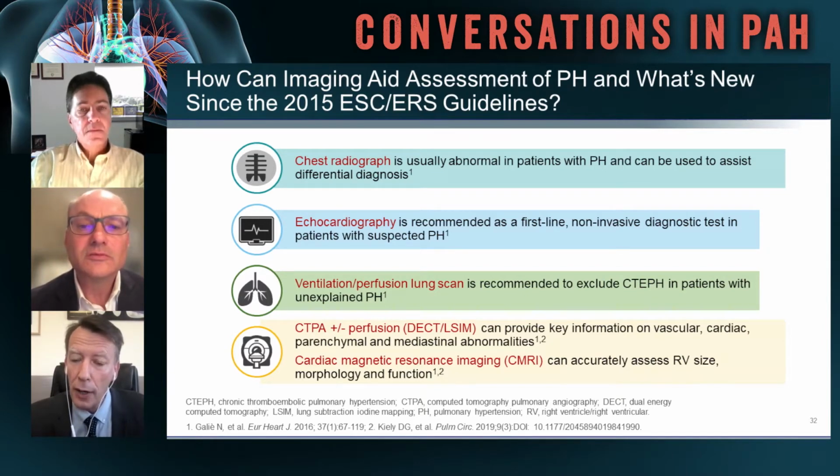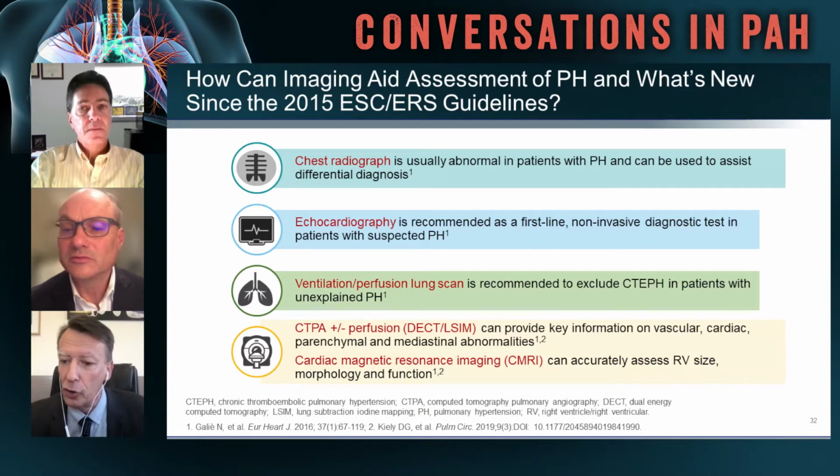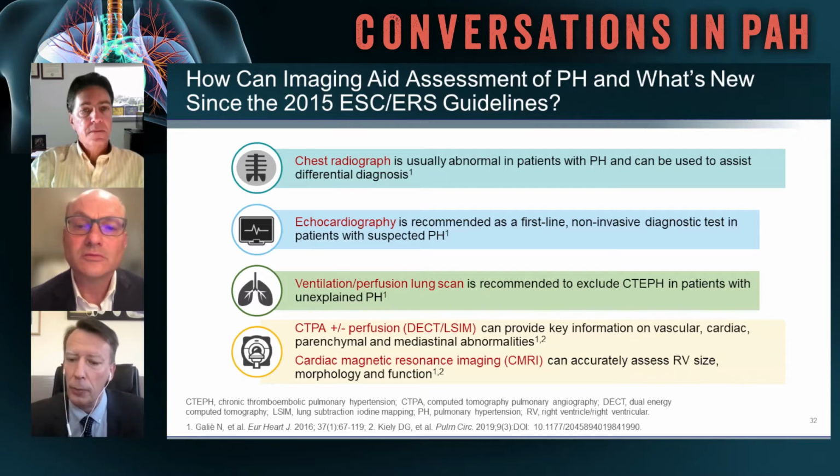Regarding MRI, it is very important to emphasize what Dunbar has said. It is a superb instrument. The difficulty is to have access to it. So worldwide, when you work in a major university campus, you have access to MRI, but in the community, it is certainly something we have to develop and promote and find solutions for our rare patients to have access to MRI.